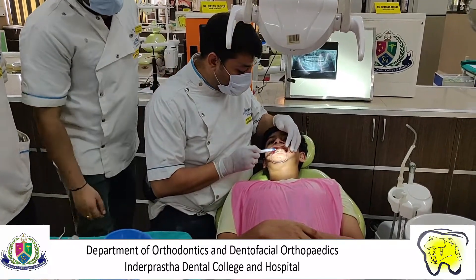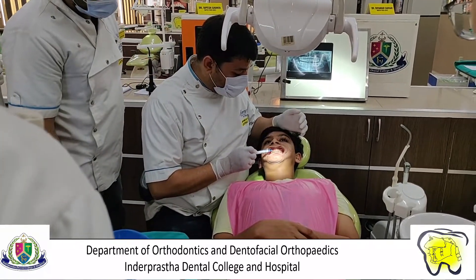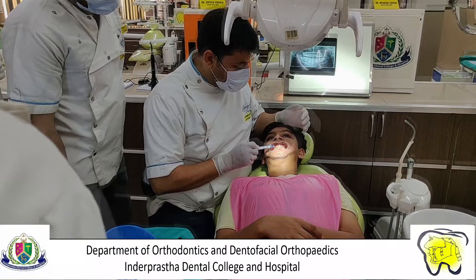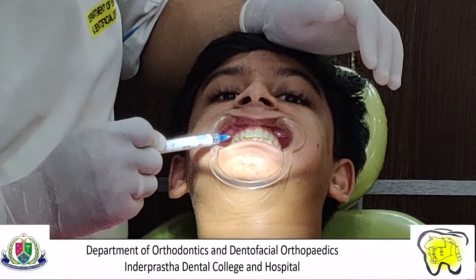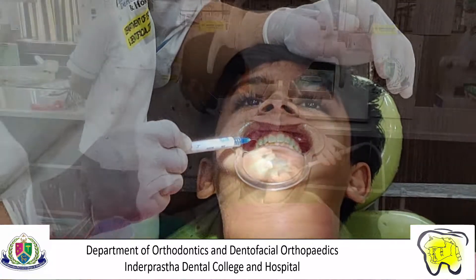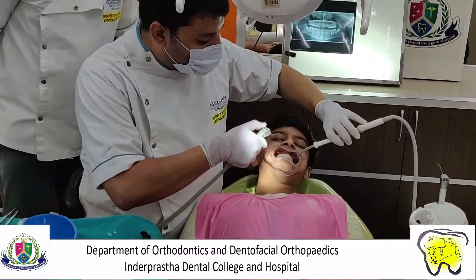Etching is done on clean and dry teeth to create micro-porosities in the enamel for efficient bonding and to increase retention of adhesive. It is done for 15 to 20 seconds, ideally using 37% phosphoric acid gel.